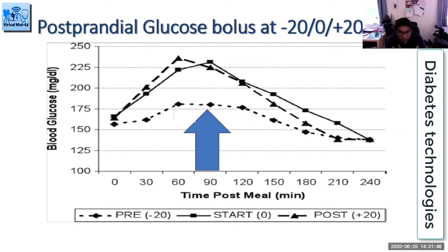So there's a lot to be said. If a patient is able to bolus before, by all means, I would go for it. And this is particularly true for the newer hybrid closed-loop systems, such as your 670G hybrid closed loop. We normally advocate you really need to bolus 15-20 minutes before to flatten the curve, because if not, the system will have to give a huge amount of insulin, the alarm will go off, and it's just going to create a bit of chaos. So you need to plan ahead.